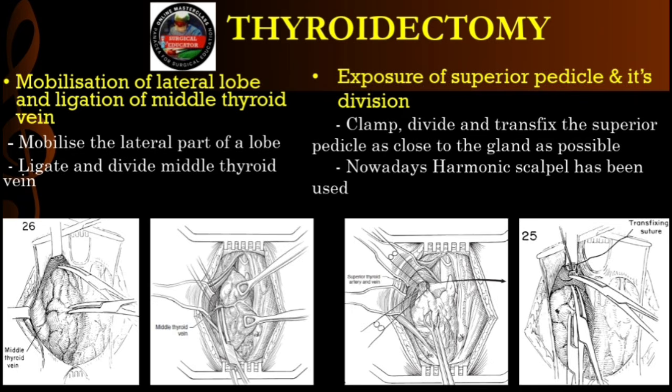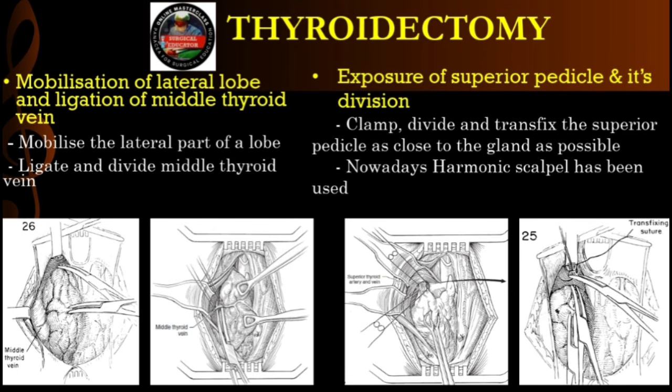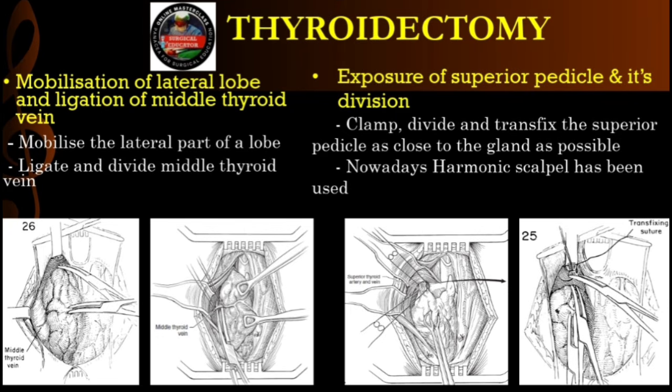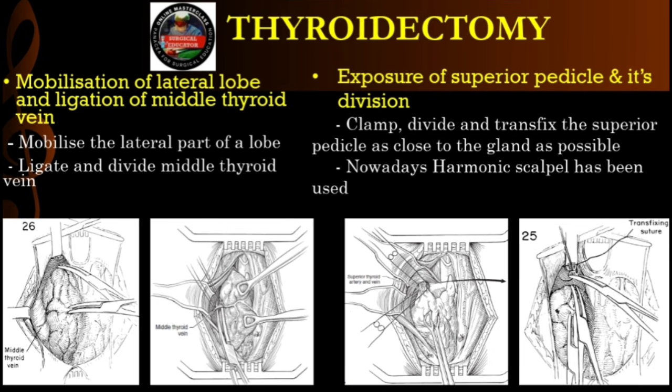Right. And the middle thyroid vein is notoriously short, sometimes just millimeters long, and paper thin. Oh, wow. And remember, you're currently pulling the thyroid gland medially to see it. If you pull too hard, you transfer all that tension to the short little vein, then it avulses. It physically tears right off the side of the internal jugular. Suddenly, you have a gaping hole in a major high-flow vessel. Dark blood floods the neck instantly.